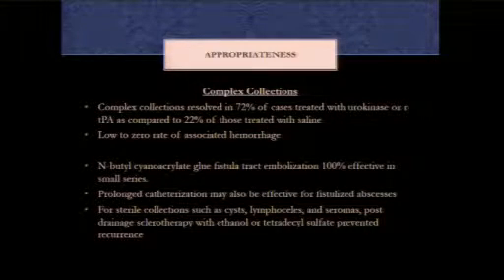If you have an abscess that fistulizes with the GI tract or other systems within the abdomen, you can try using ablation of that tract with glue, and that's been shown in a small series of 11 patients. It was shown to be 100% effective. So these are kind of more troubleshooting measures. Prolonged catheterization can also be effective for fistulized abscesses in clearing them, but it takes some time.